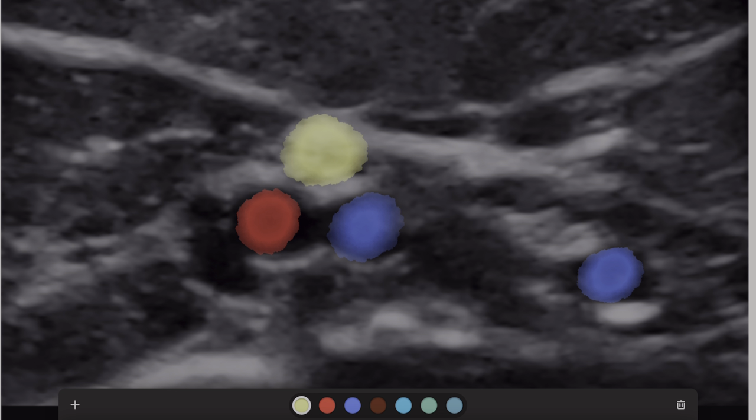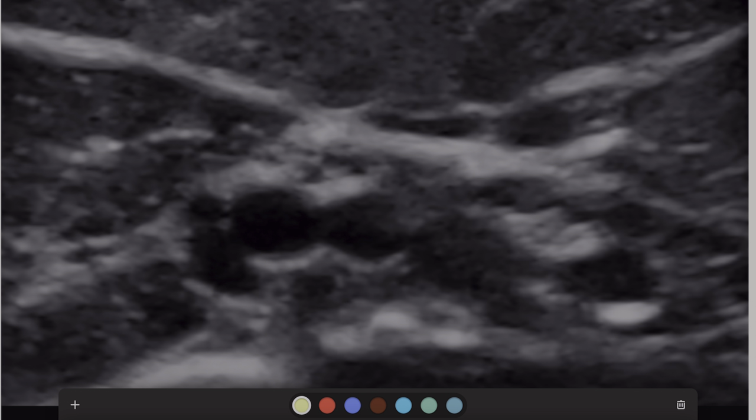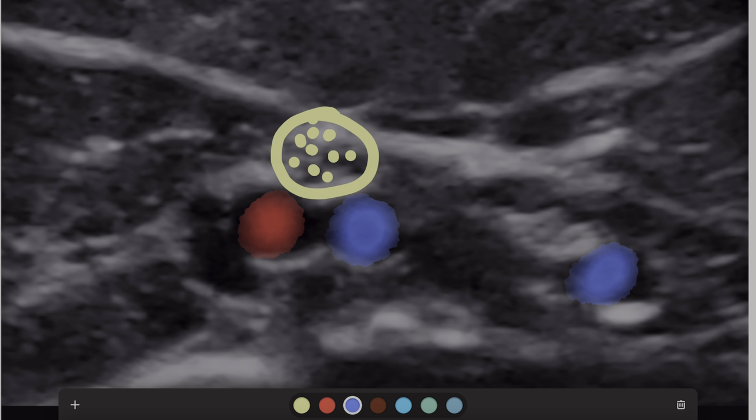Nerve bundles do compress, but they are the least compressible structure. From my experience, the arteries and veins will compress before you can even compress a nerve bundle — and compressing a nerve bundle will be very uncomfortable for the patient, which will help you identify it. You can see it's kind of spotty — almost porous, or what someone described as a chocolate chip cookie or honeycomb — and the inside is quite porous. Those are usually the nerve bundles. The nerve bundle has a very tough outer layer. It is hard to puncture, and they will generally move out of the way. However, if you are persistent in chasing after it or ignore it with a straight-down vector through the center, you will poke through the brachial nerve complex.